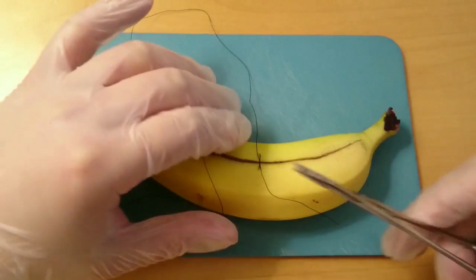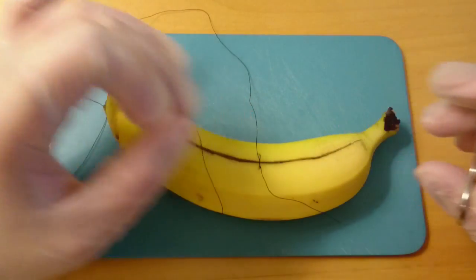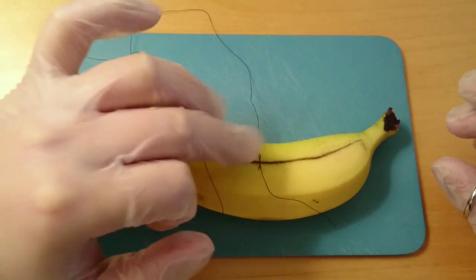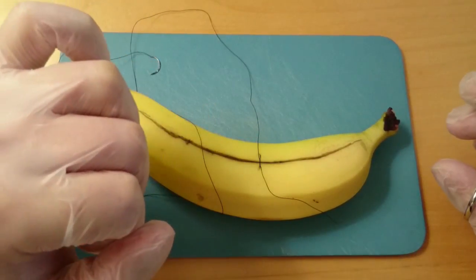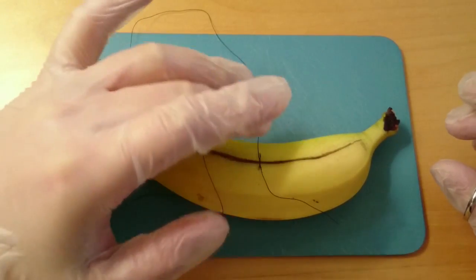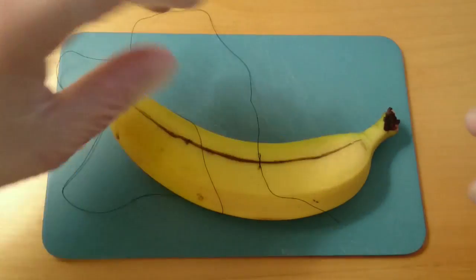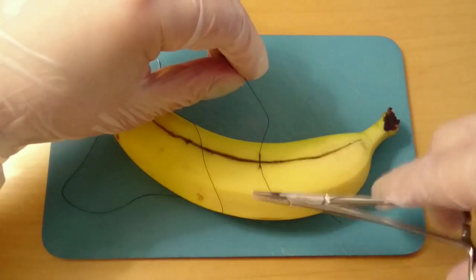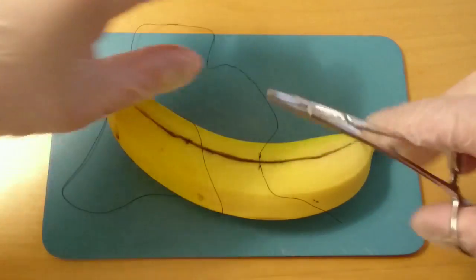Be careful not to put too much force. If you make a suture too tight, the tissue will get necrosed because it won't be able to get enough nourishment. It's sufficient force when you pull it together.